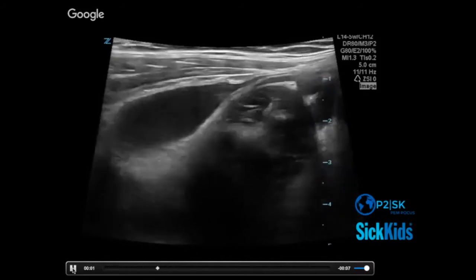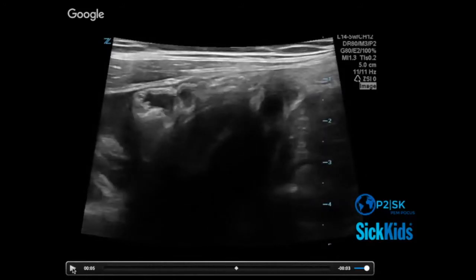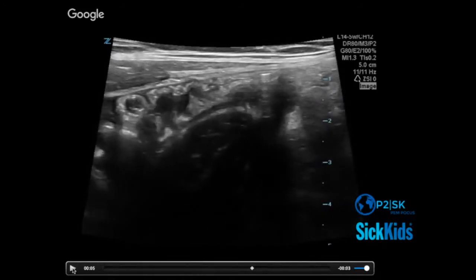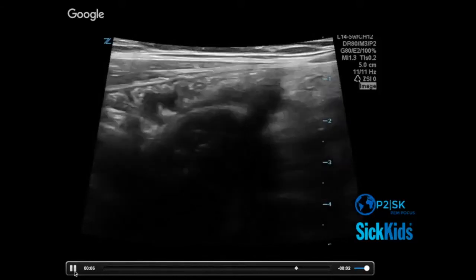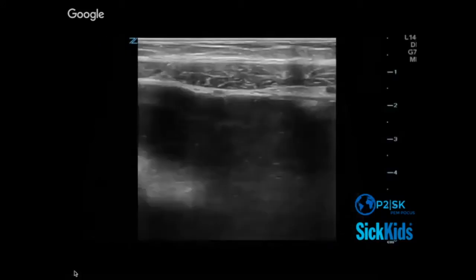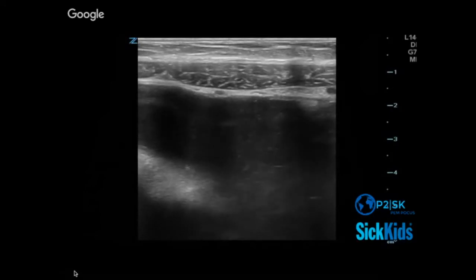You also get inside the bowel itself the sense that there's almost like a crystal or snowball kind of appearance too. I don't know if that's these echoes that just tinkle around, like stuff that's been sitting there a long time. And this one is not the kind of clip that I want to teach, like, hey, go out and look for this stuff, because this is the really rare case.